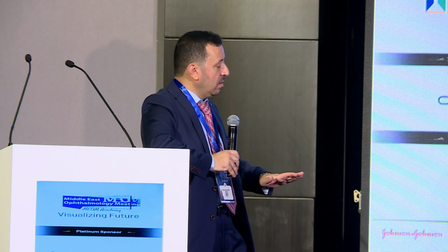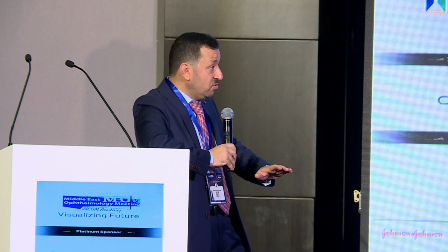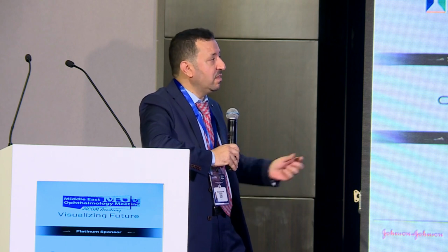Exactly, Dr. Ashraf, and I was guessing so because of the severe manipulation. When you have the initial wound extended, that means the surgeon has suffered to extract that lenticule. That's why I assumed that there was a lot of manipulation and there is a problem in the power. Thank you so much. Thank you.